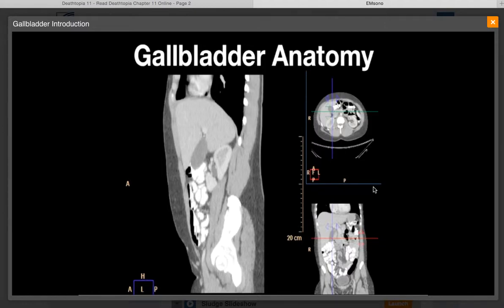The neck of the gallbladder is fixed in the fossa and has a fixed relationship to the main lobar fissure, which we'll be showing on upcoming ultrasound images. This is an important landmark that will be discussed during the ultrasound examination. Since the body of the gallbladder is not fixed, it can move to a variety of locations in the right upper quadrant, particularly with changes in patient position.